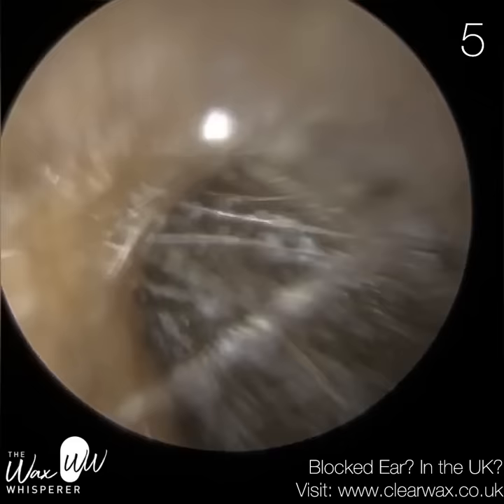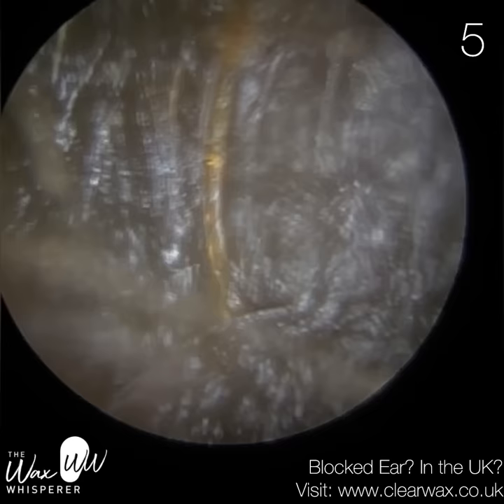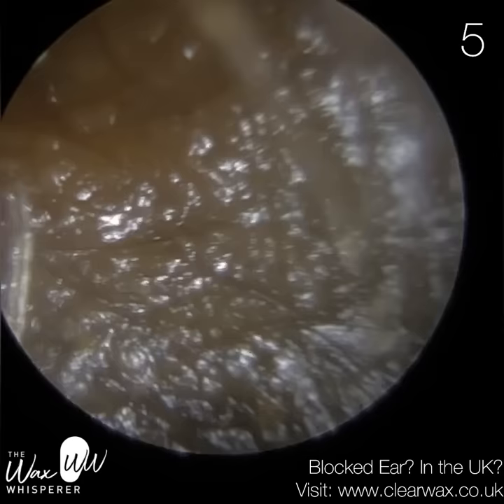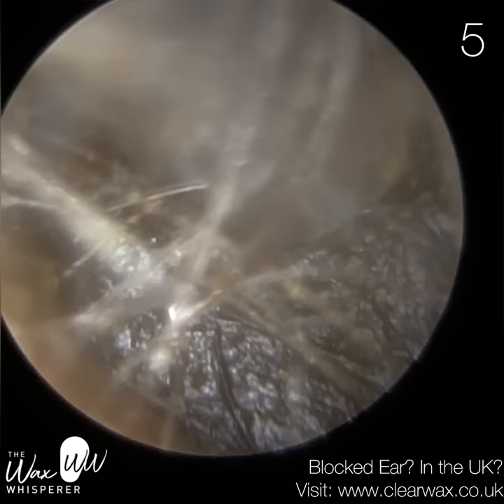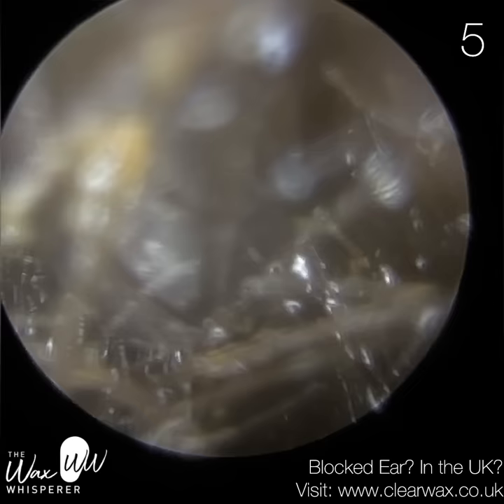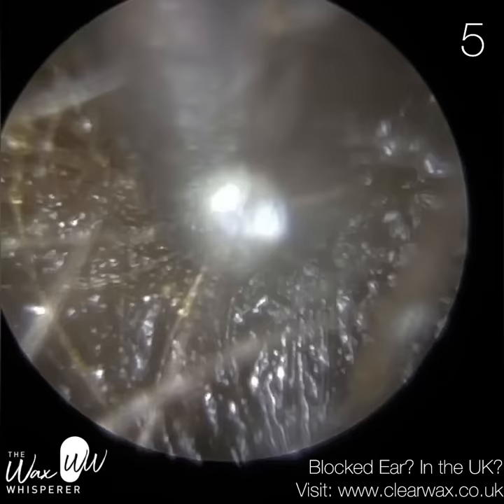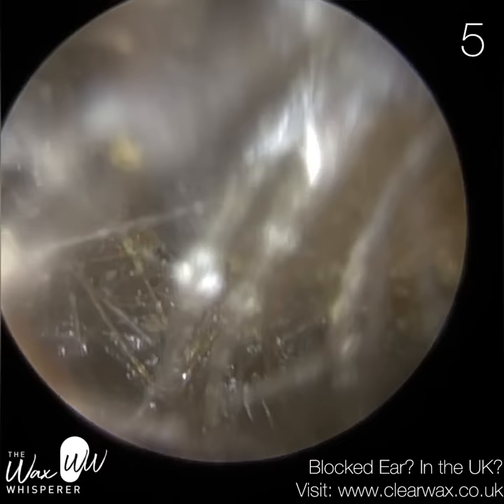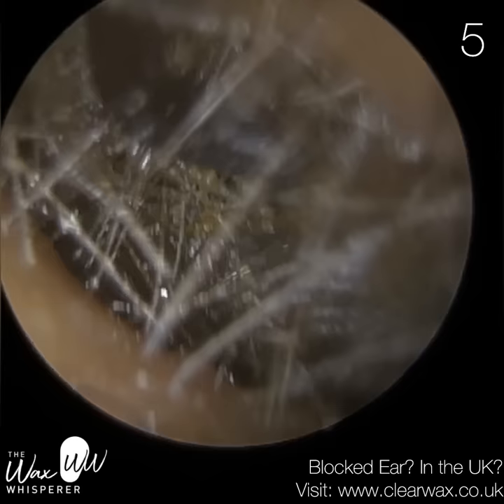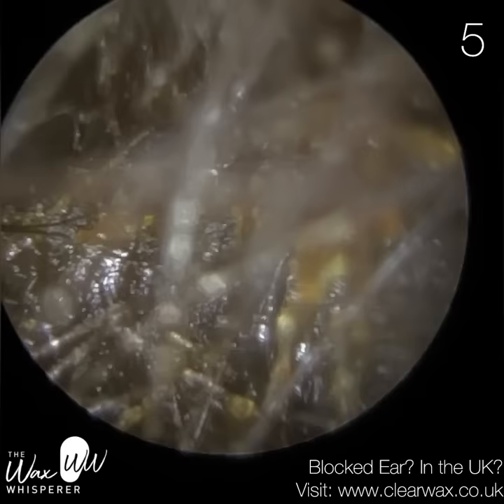Patient five has got a lot of hairs at the entrance of the ear, and the earwax is really dark. We know this earwax has been there for a while — we call it vintage earwax. It's oxidised and become dark, so it's been there for many a moon. These hairs are more common in male patients. From my research, older men develop more hairs in the ears and nose, which appears to be related to testosterone levels — though the exact mechanism is a bit contradictory. It's definitely more common amongst men, and it would appear to be a hormonal reason.